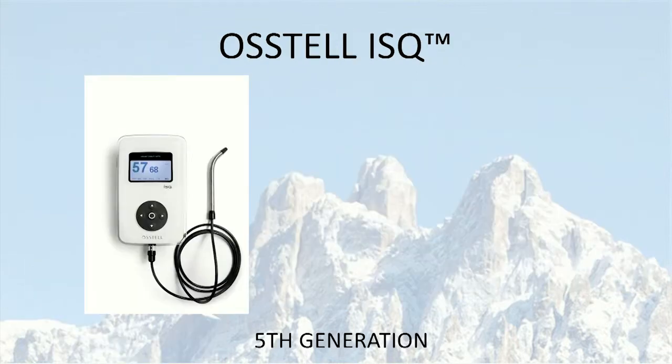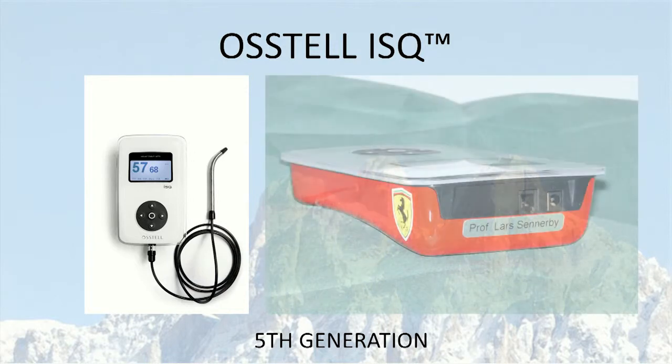And this is the instrument we're using today. That's the Osstell ISQ machine. And if there is a difference between the lowest and highest ISQ level, you will see that on the display as shown here. This is showing 57 and 68. So you have a low value and you have a high value. So it's easier then to pick up.